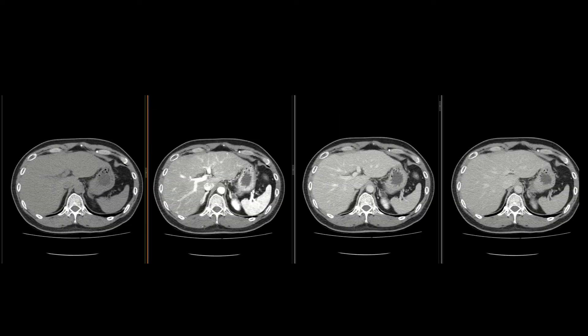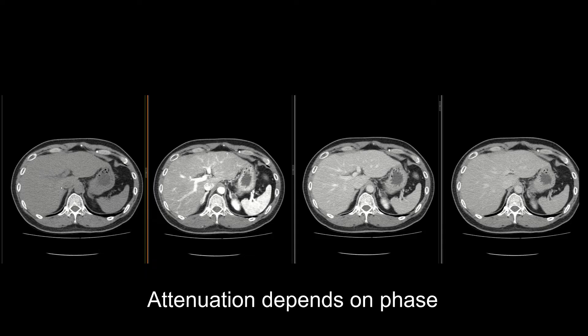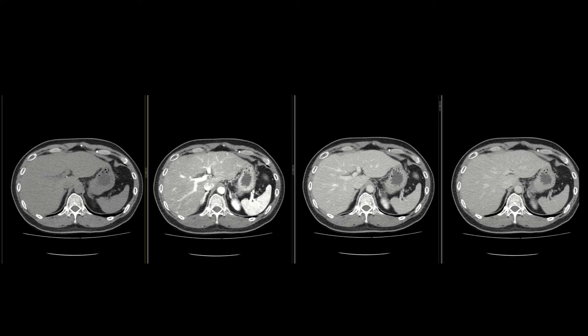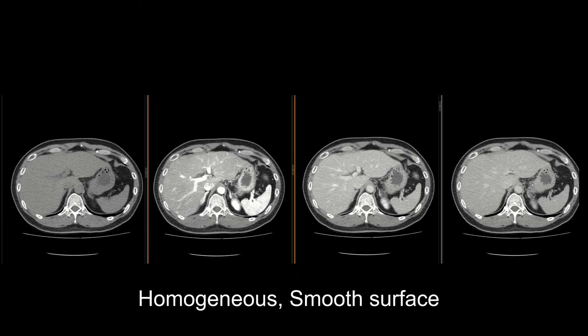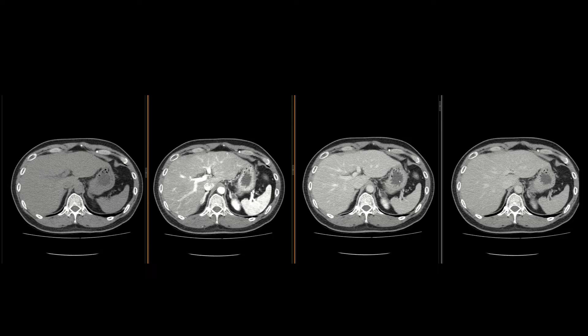Let's look at this four-phase scan of a normal liver. You'll notice that the appearance and attenuation of the normal liver depends heavily on the phase of IV contrast, but the normal liver is pretty homogeneous on all of these phases. Normal liver has a dual blood supply: about 75% from the portal venous system and about 25% from the hepatic artery.